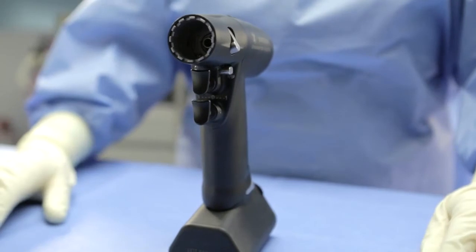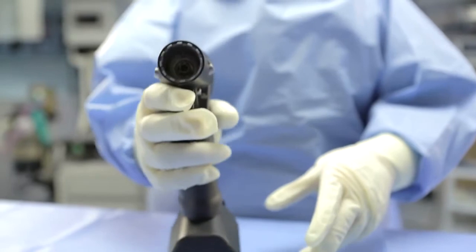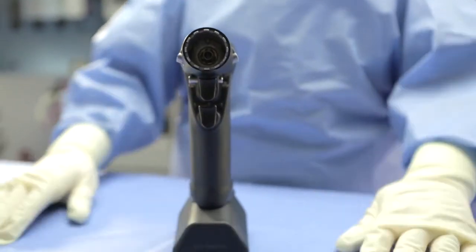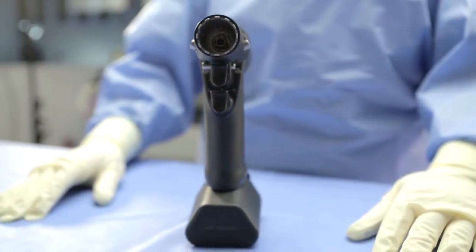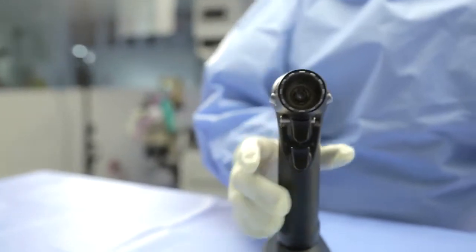Ensure that the connection has been made by pulling on the trigger of the handpiece and listening for the motor to engage. If the motor engages, place the handpiece on the sterile field and continue with prep for the procedure. If the motor does not engage, be sure to check that the safety switch is not in the neutral position.